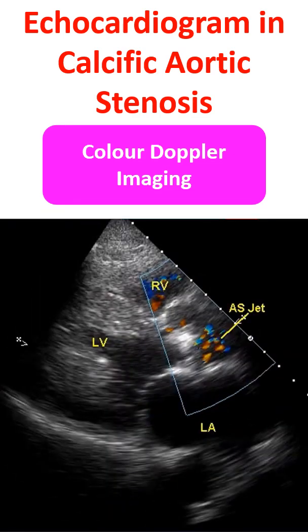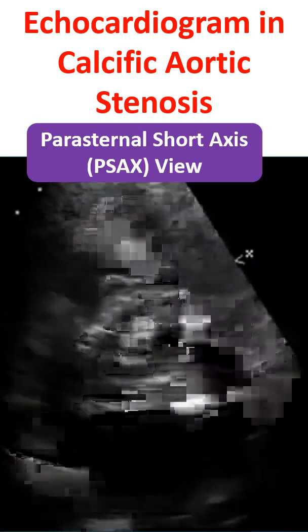Still image from parasternal long axis view with color Doppler showing the aliased jet beyond the domed and densely calcified aortic valve.